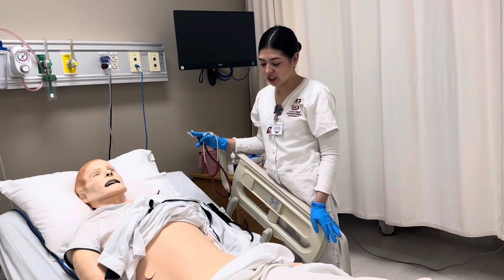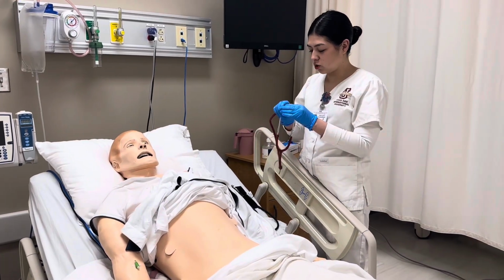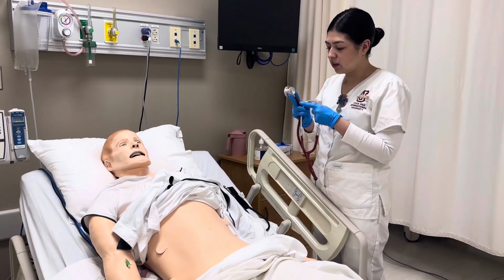Okay, so all four quadrants have hyperactive bowel sounds. Okay, now I'm gonna go ahead and switch to the bell, and I'm gonna go ahead and listen for any bruit. So I'm gonna start at the aorta.